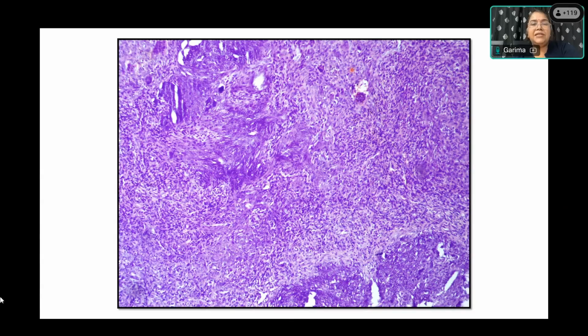This is a giant cell. And these giant cells, showing the stromal, these fibroblastic cells, they are proliferating. Very good, you are very correct. There are some fibroblastic cells which are proliferating, but you are seeing many. What is this which you are seeing? Can you appreciate this bluish hue which is present? Yeah, ma'am. Okay. Sorry, ma'am.